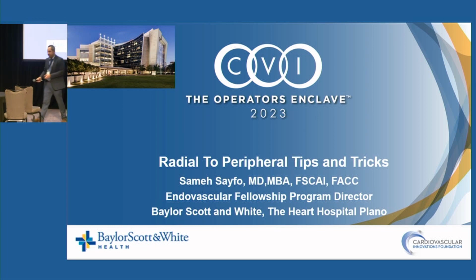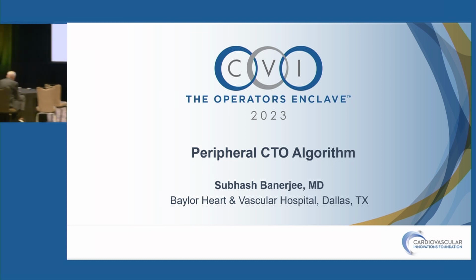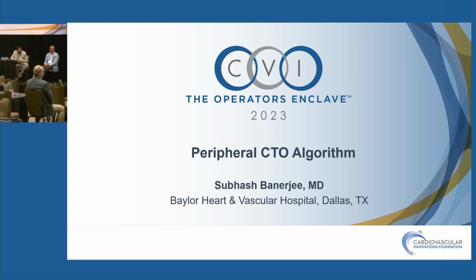Thank you very much, Dr. Sayfo. In the interest of time, I'm going to skip over Dr. Banerjee's talk. And as the media people are pulling up Dr. Younes' talk, I want to ask Dr. Kovard, with all this discussion about alternative access for these challenging cases, let's not forget that we are surgeons. Can you talk a little bit about times you might cut down on the axillary artery or the SFA, or other times you might want to consider a surgical approach as opposed to the endovascular acrobatics that we can do?